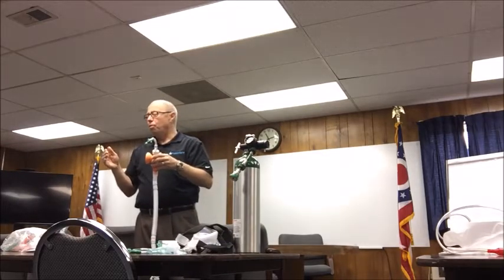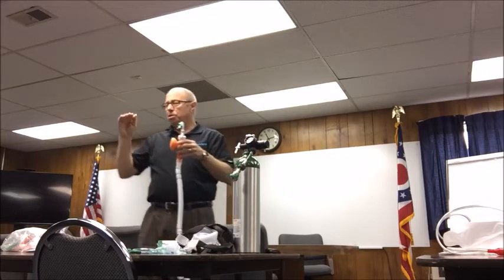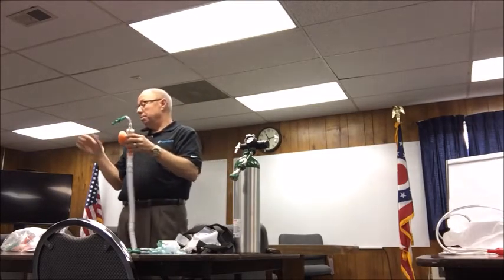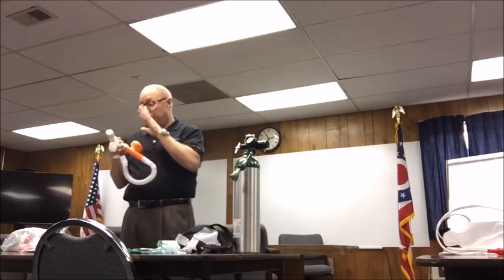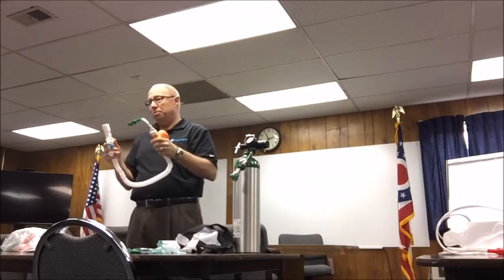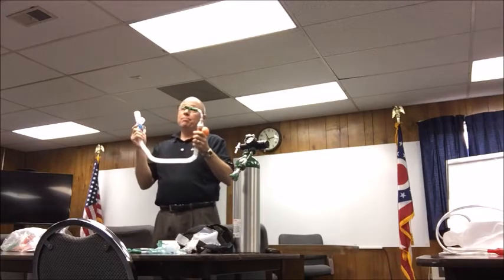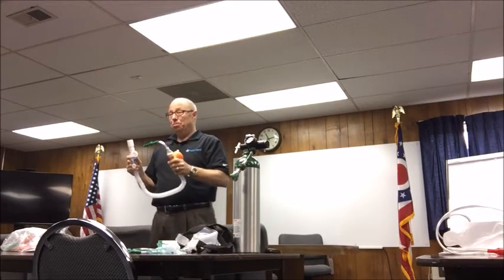You can see the waveform after you apply CPAP, and you can see if it's improved or if the patient's getting better. So it's real important to get a baseline using end-tidal. Now you're using the capno line, right? Yes. Perfect. A lot of people think they can use the intubated line, and there's too much dead space and everything else. One of the other advantages of using the capnography is it's a diagnostic tool.